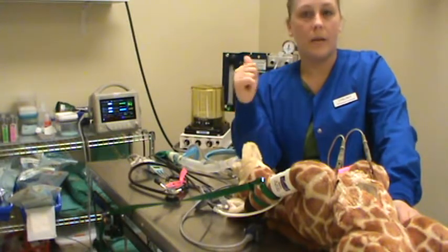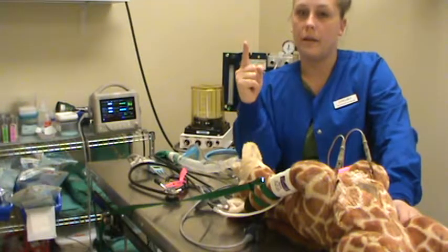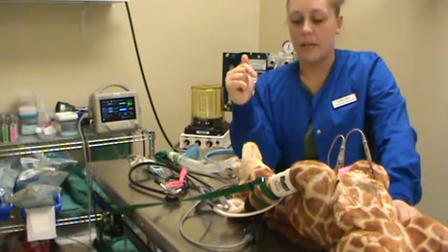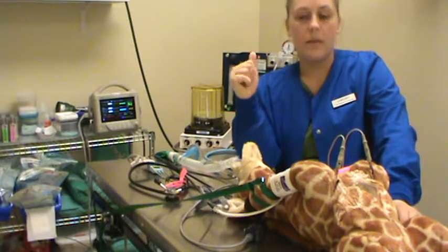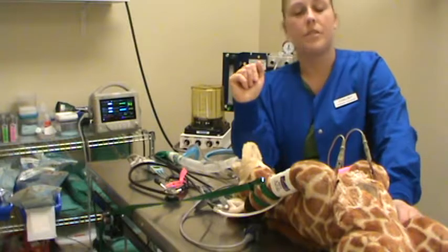When they're waking up and they're too light, they're going to have an increase and have some tachycardia. So we watch that, and if I hear heart rate kind of starting to go up, I know that I need to adjust that isoflurane up to another percentage.